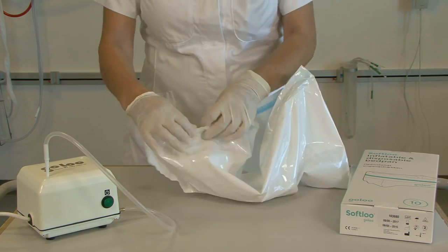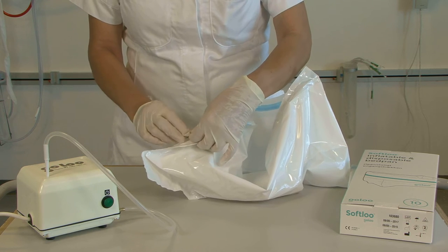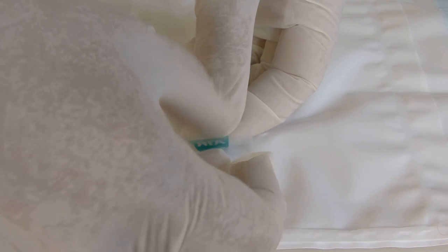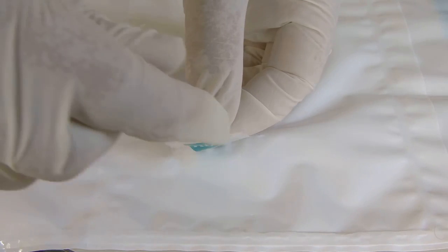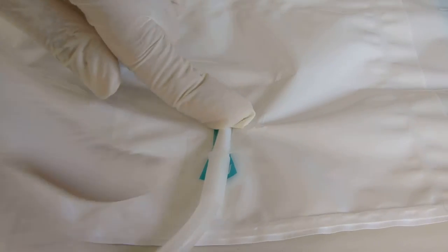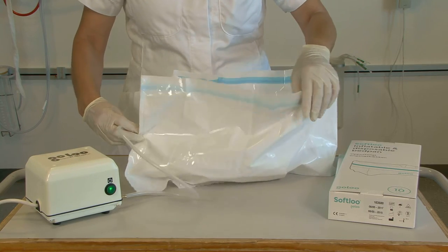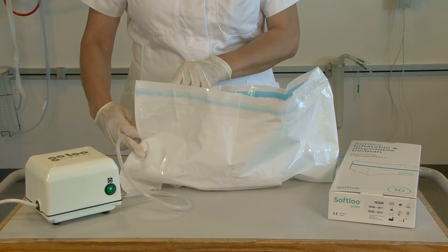Locate the inflation point marked AIR. Separate the plastic tabs to open the air intake. Insert the pump nozzle into the air intake.